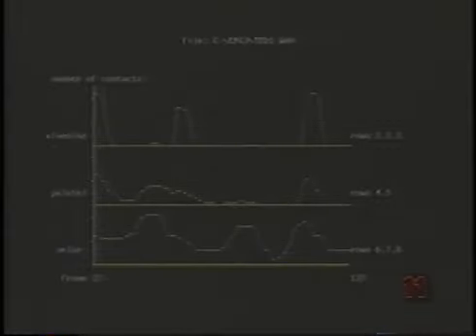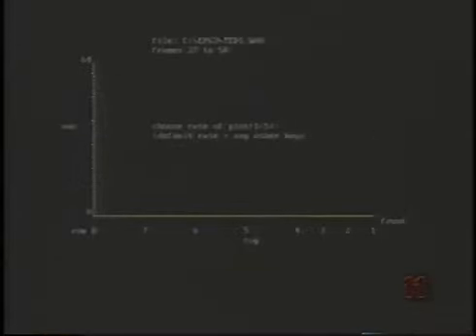Another data reduction facility is a centre of gravity plot. Centre of gravity shows a concentration of contacts in different parts of the palate. Here the centre of gravity is plotted as a function of the total number of electrodes. The graph shows movement in the centre of gravity from the front of the palate to the right of the graph to the back in the word TED, spoken here with the assimilated final plosive.